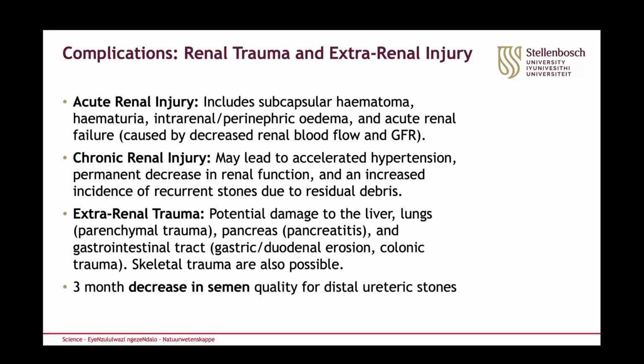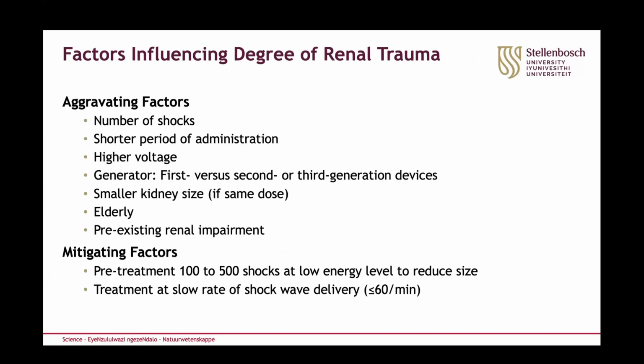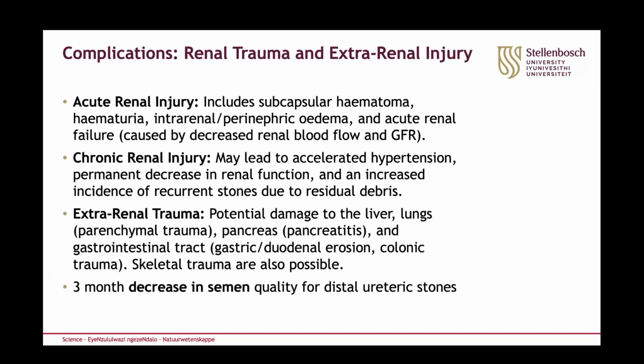Extrarenal traumas include potential damage to the liver, as we've mentioned, the pancreas, gastrointestinal tract, and colon, as well as skeletal injuries. And then there could be a 3-month decrease in semen quality for stones in the distal ureter that have been exposed to shockwaves as well.